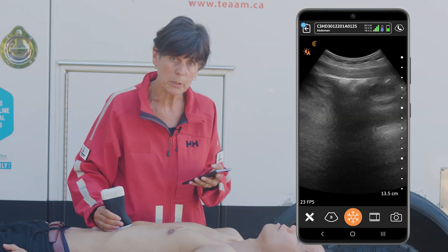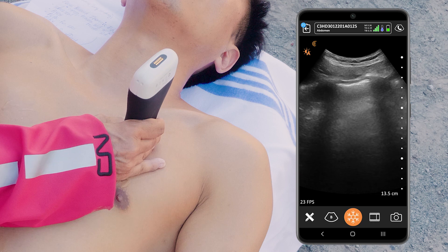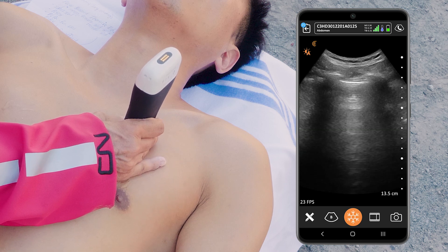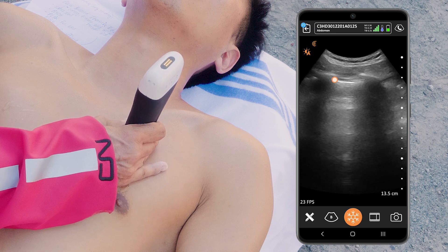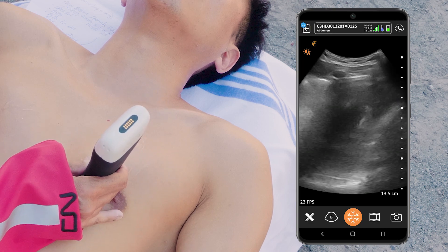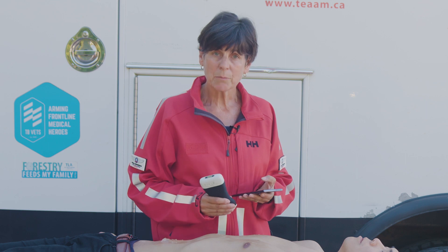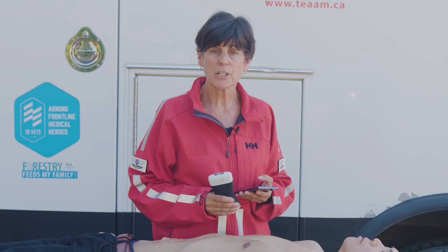The last thing I'm going to do is have a quick look at the lungs for pneumothorax. I'll place the scanner in the sagittal plane on the lungs and look between the rib spaces, which are casting black shadows, and we're going to look for lung sliding. If we see lung sliding, we can be confident that there's no pneumothorax in this patient. I'll look from a couple of different areas and then do the same thing on the right side of the chest. With that, we've completed the RUSH exam and found no obvious cause for our patient's undifferentiated hypotension.